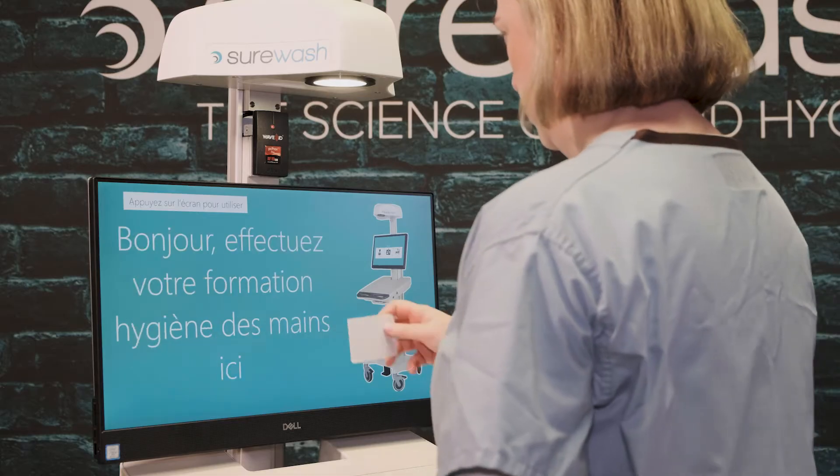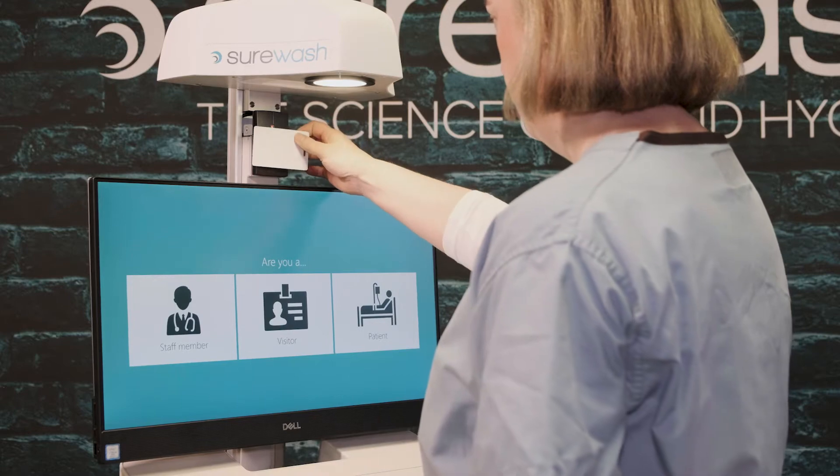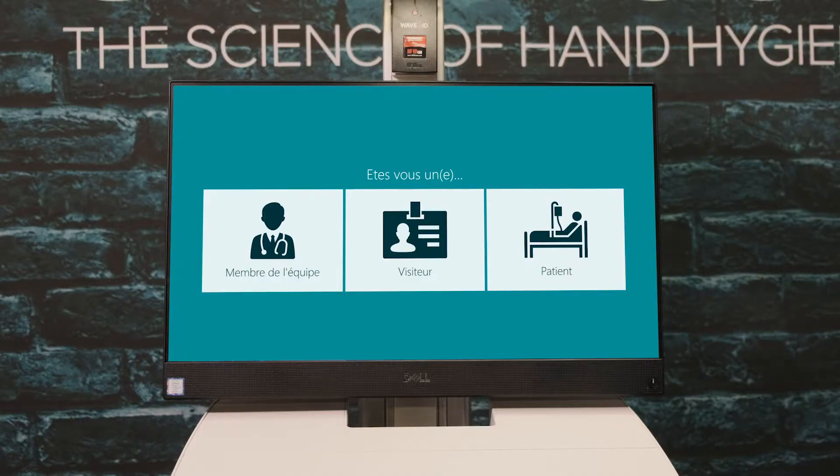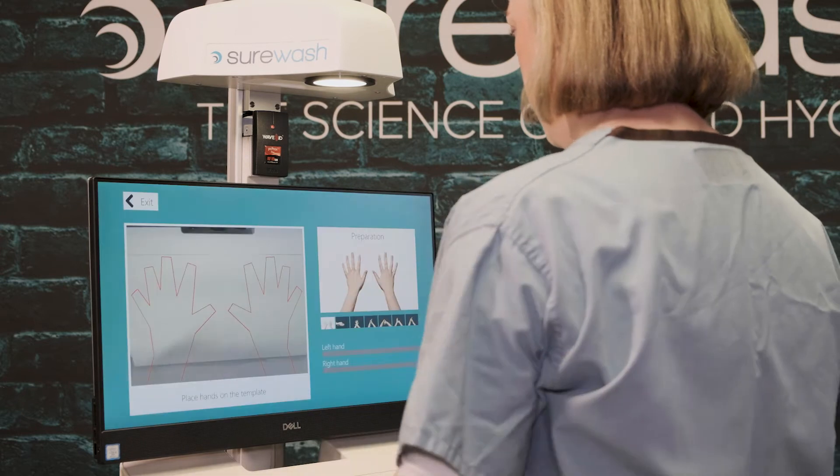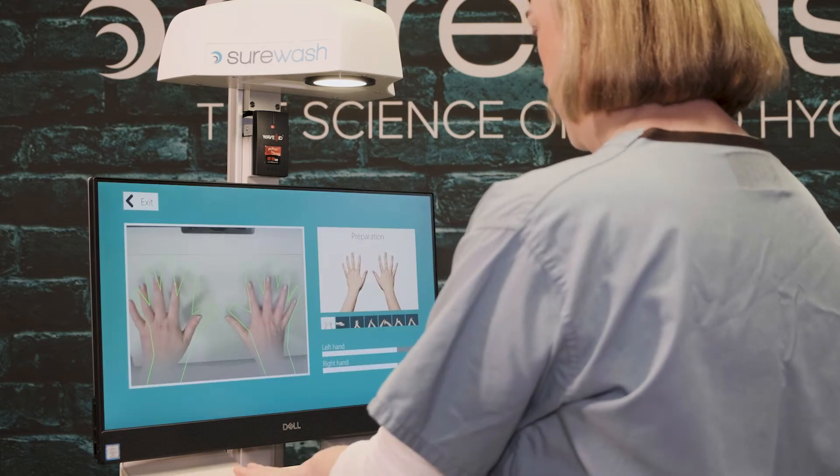To begin using Surewash, press the screen. You have the option to log in as a staff member, patient, visitor, athlete, or resident depending on your organization. You can log in by typing in your staff ID or by using the RFID badge reader located above the screen.